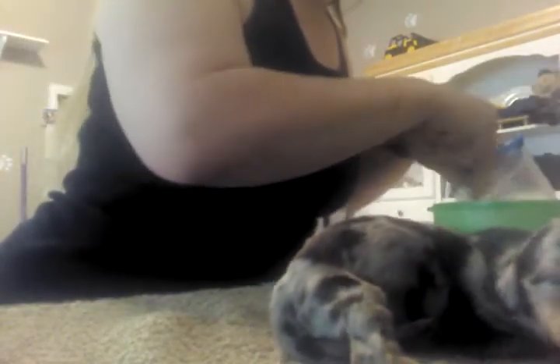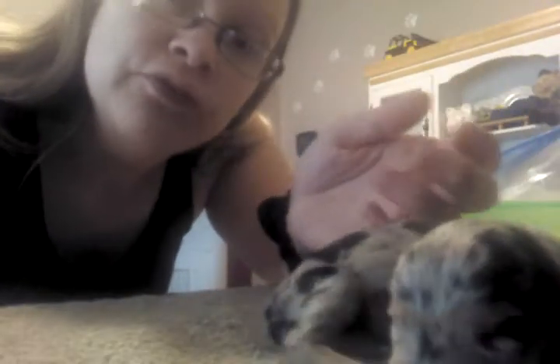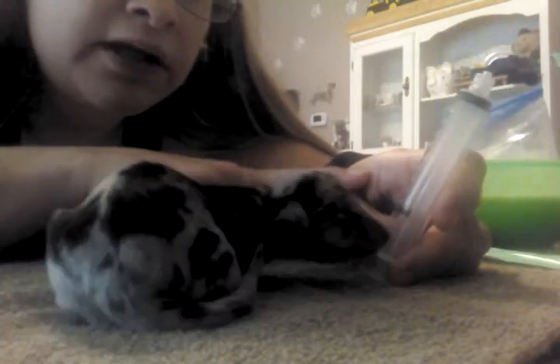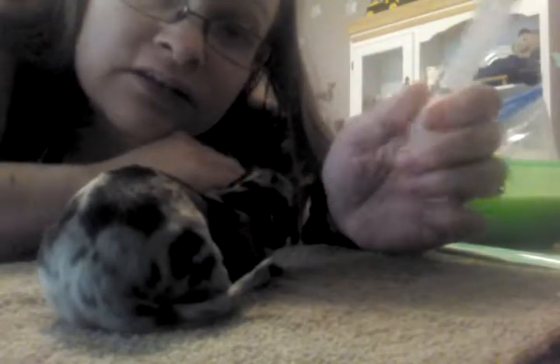The stuff you're going to need — you can get these from the vet. Things you're going to need: a 10 ml syringe with no needle on it. A luer lock top will help to get the catheter on — the luer locks are best. A 10 cc syringe, or 10 ml syringe — same thing. You can get these online or from your veterinarian. If you get them online, you don't have to explain to your vet. If your vet doesn't give you a lot of hassle, he'll give them to you — they're only a couple bucks if you buy them online.